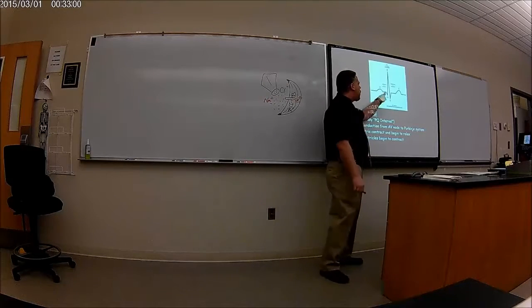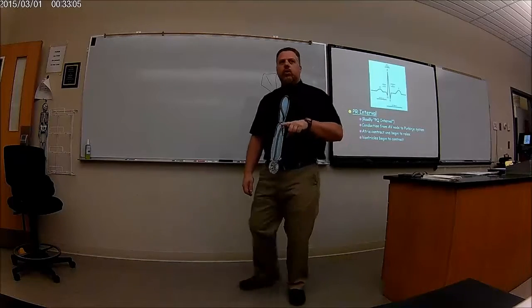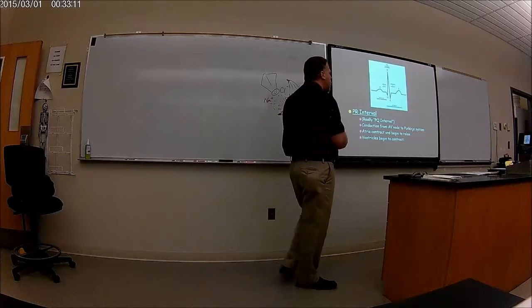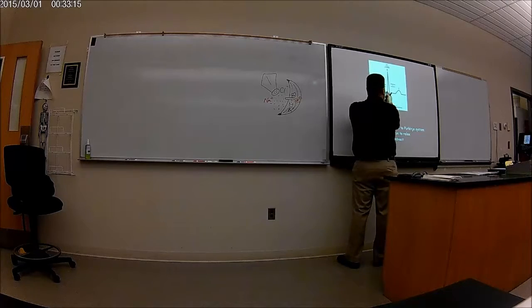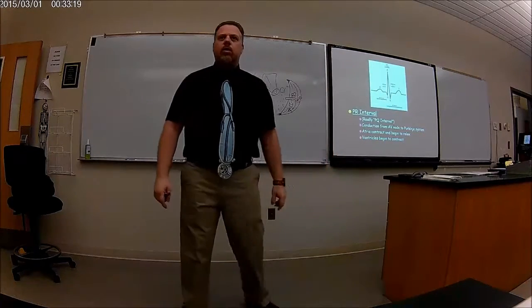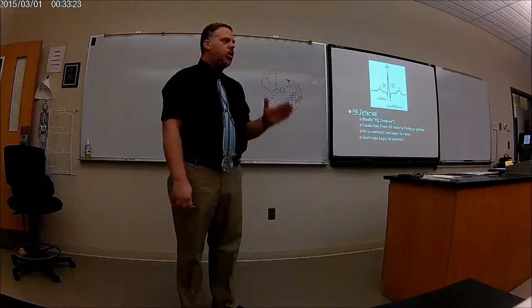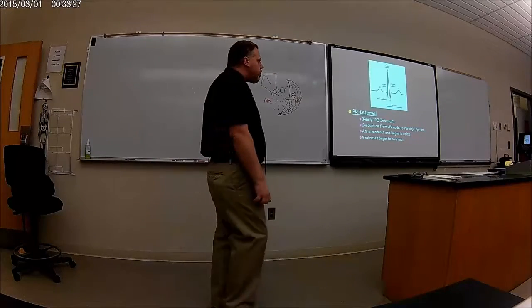This is also the time at the end here, the ventricles begin to contract. Okay? So you can understand that to read these things, if this becomes like a longer area, there's something going on here. It shouldn't be that long. So that's where they measure things, and they get an idea with this. You have these little graphs, these boxes, which we'll talk about.